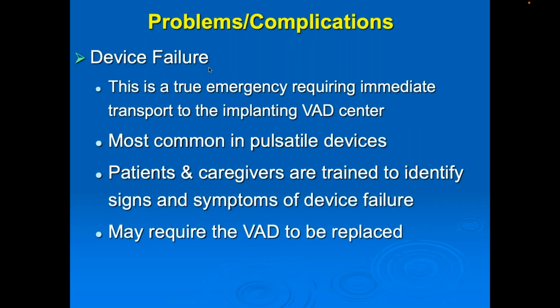Device failure is a true emergency requiring immediate transport to the implanting VAD center. Now, it doesn't mean that you take your 911 ambulance and transport to Tufts Medical Center in Boston. Bring them to the closest facility and they'll arrange for transportation. It might either be through air medical transport or by ground. Patients and caregivers are trained to identify signs and symptoms of device failure and may require the VAD to be replaced.